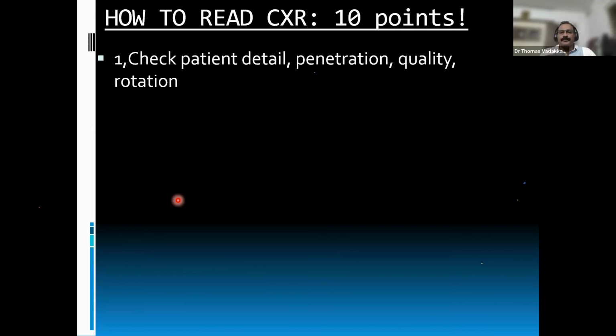Sometimes you might get a previous X-ray. I have seen patients bringing an old X-ray, and we think that the pneumonia is still there, but unless you check the date, you will be confused. So date checking, name checking. The patient may bring another patient's X-ray, or the X-ray technician might send another X-ray. So these issues are not very rare. So be vigilant. Confirm whether your X-ray belongs to that patient, and the date is confirmed.